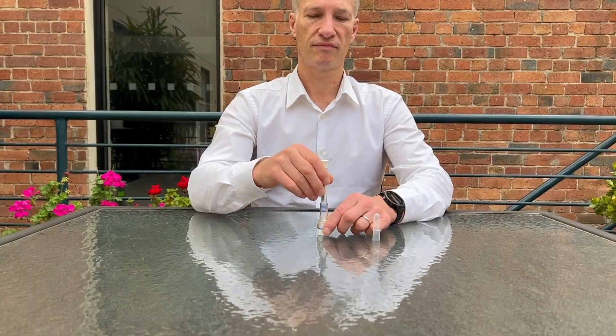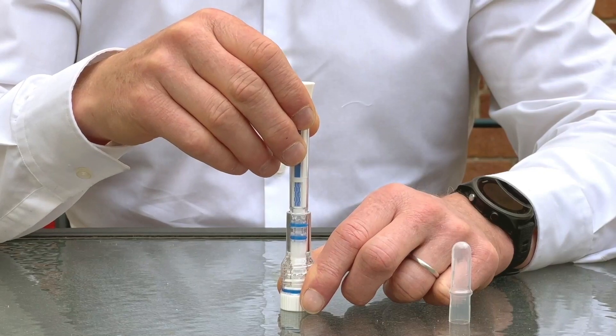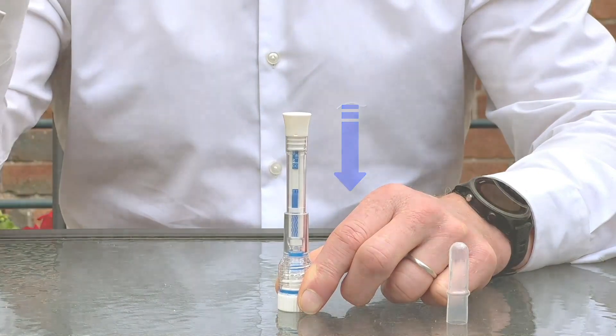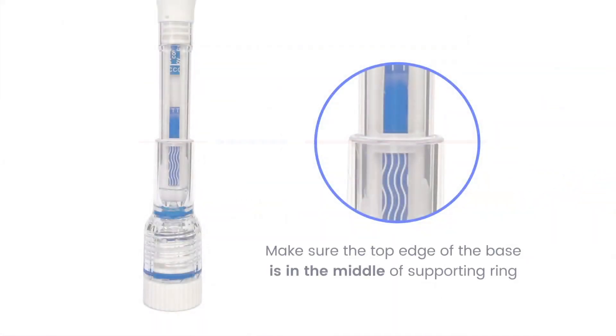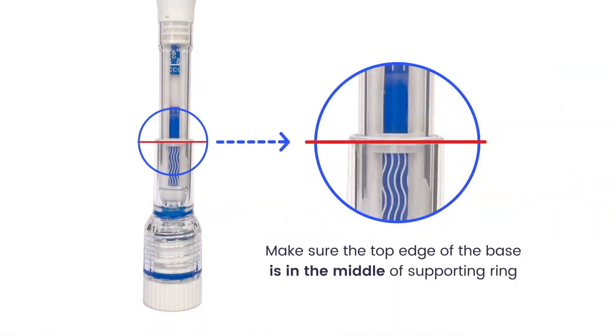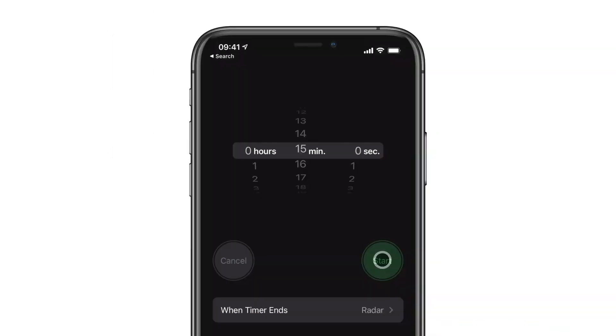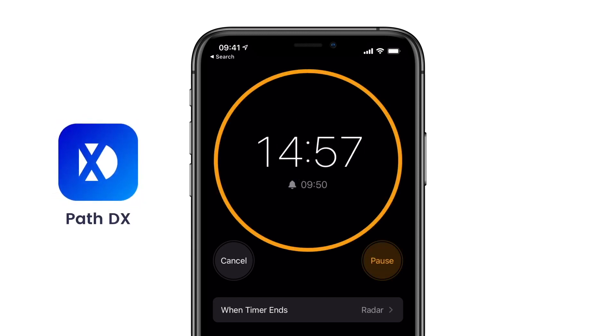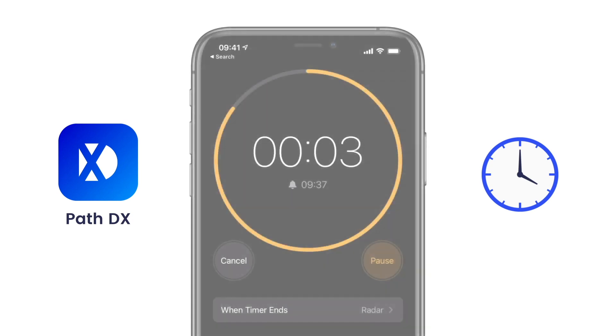After two minutes, take the collector from your mouth and hold it vertical. Now push the top of the collector into the base. Make sure the top edge of the base is in the middle of the supporting ring. Start the 15-minute timer on your PathDX app, clock, or mobile phone.